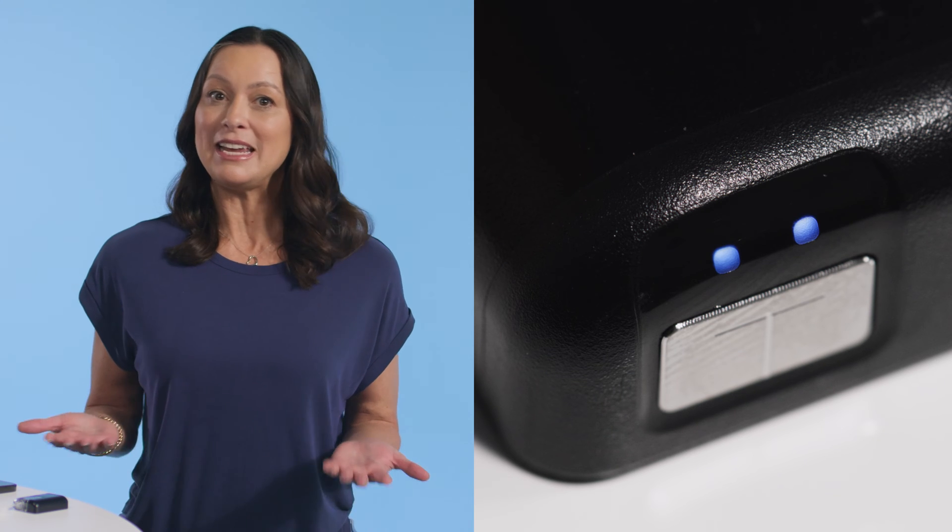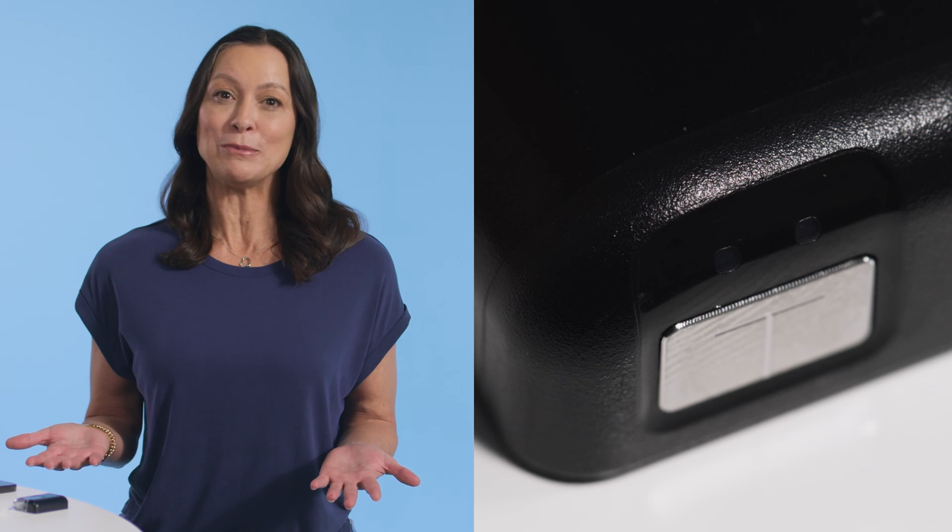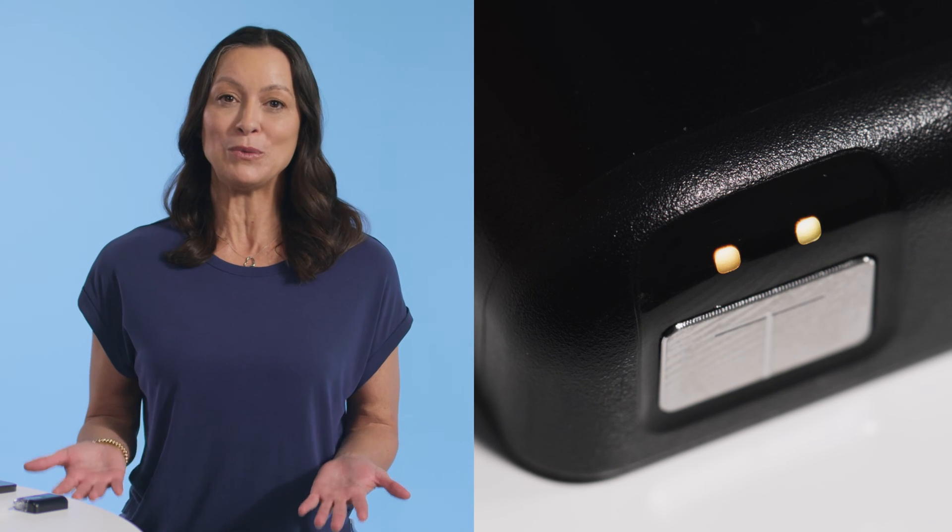The Tandem Mobi system is equipped with pump status lights that light up in different colors and patterns to let you know what the pump is doing, even if you don't have your personal smartphone with you.